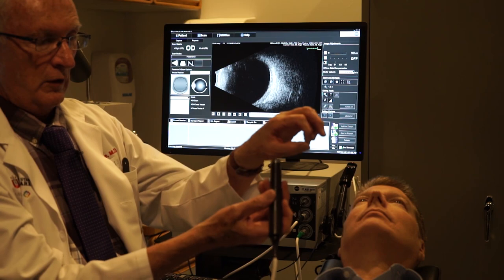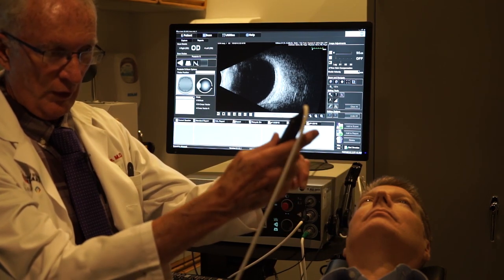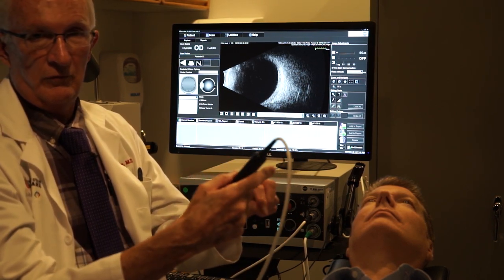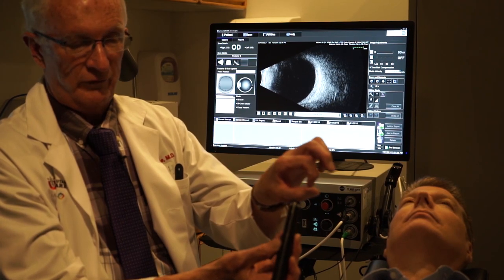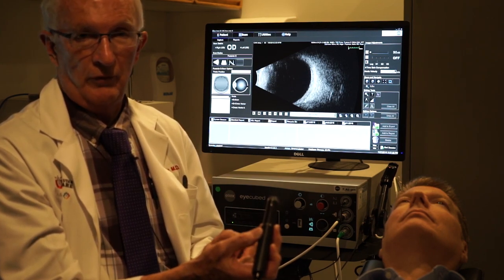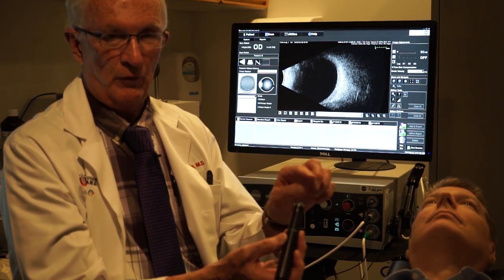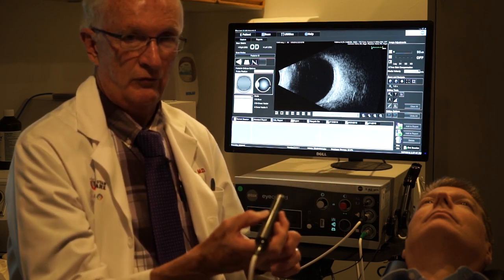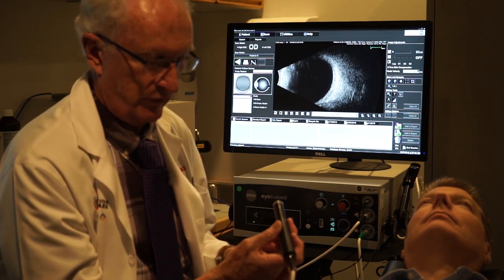In the transverse position I might be inferior pointing towards the superior globe, nasal pointing temporally, or superior pointing inferiorly. If I turn the probe so that the mark is perpendicular, that is called the longitudinal position, which gives a better peripheral examination. Each sweep of the probe covers about 60 degrees of the globe, so going around six different positions captures the entire 360 degrees of globe circumference.